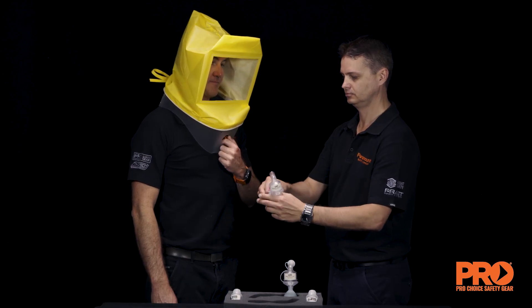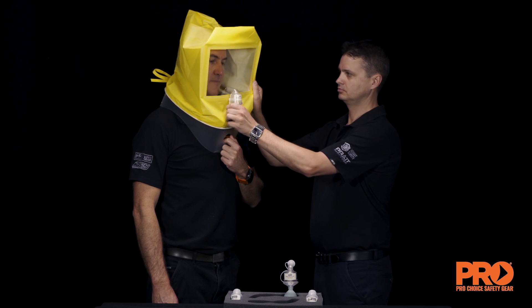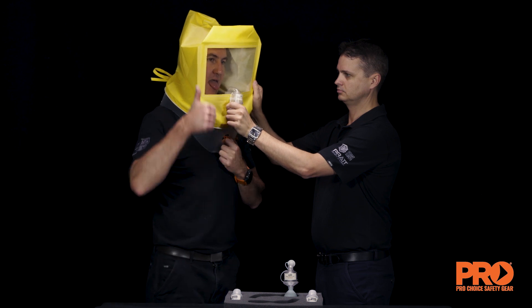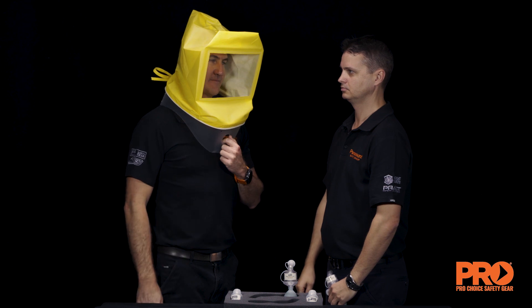If not tasted, inject an additional 10 squeezes of the aerosol into the hood. Repeat with 10 more squeezes if necessary. Note whether 20 or 30 squeezes produced a taste response. If 30 squeezes are inadequate — that is, the test subject does not detect a bitter taste — the test is ended and another type of fit test must be used.